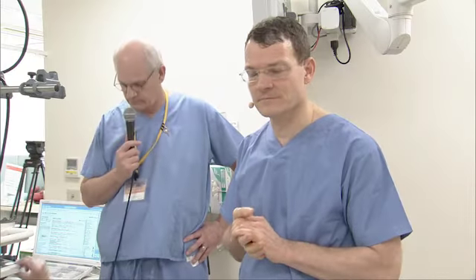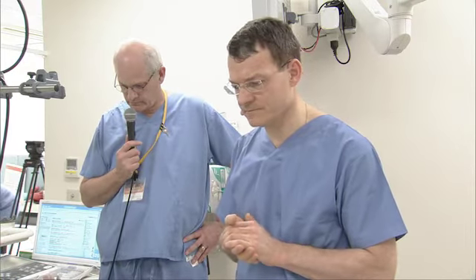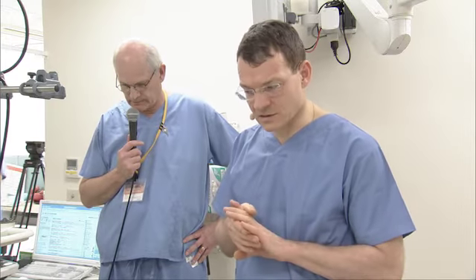Yeah, and from the ultrasonographic view, the main tumor is 1 centimeter. Yes. And the tumor has a clear, demarcated margin from the ultrasonographic view. Yes. And it is within the pancreatic duct. Yes.